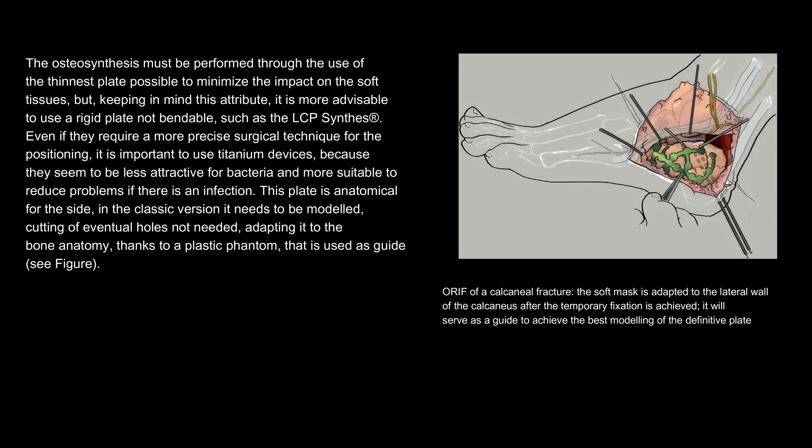ORIF of a calcaneal fracture: the soft mask is adapted to the lateral wall of the calcaneus after temporary fixation is achieved, and will serve as a guide to achieve the best modelling of the definitive plate.